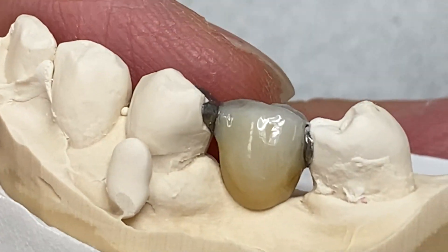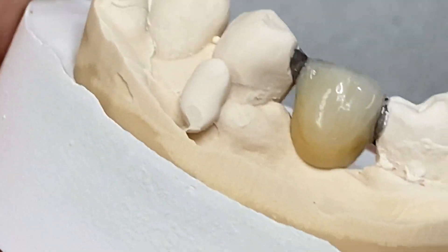The glaze with light cure. It's a great job, great vitality.